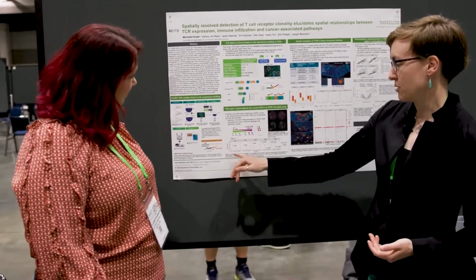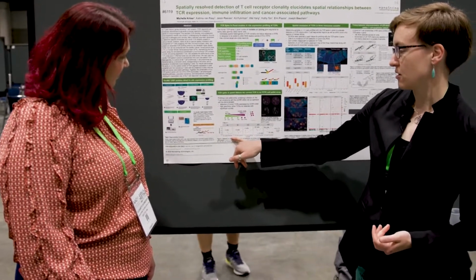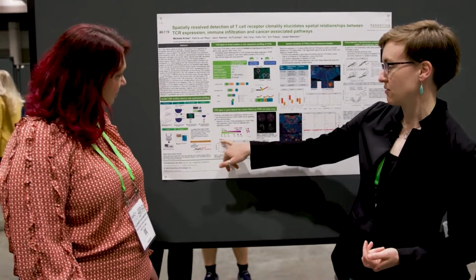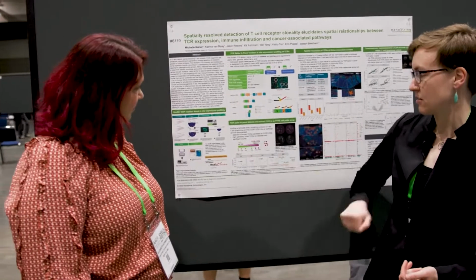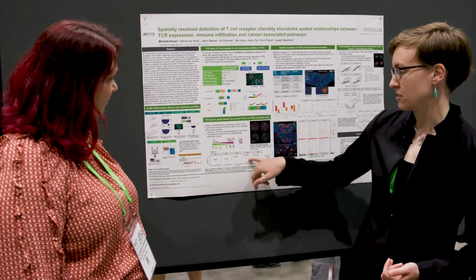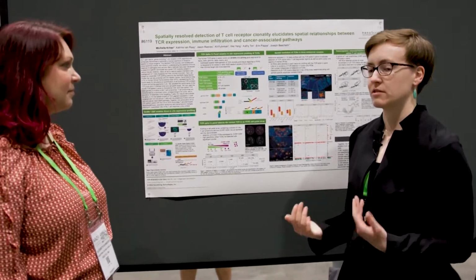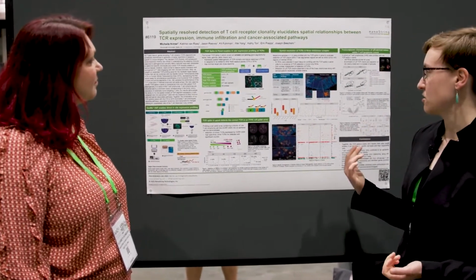You see in different sized ROIs, as you increase the percentage of T cells in your ROI, you start to see expression of the expected TR beta chain V variable region 3-1, which is the one expressed by this cell line CCRF-CEM, and we see that there's a dose response in its expression in this experiment. So that was just to get us started to say that we're confident that we're getting specific expression and detection of our probes. And then we moved into tissue and cancer tissues.